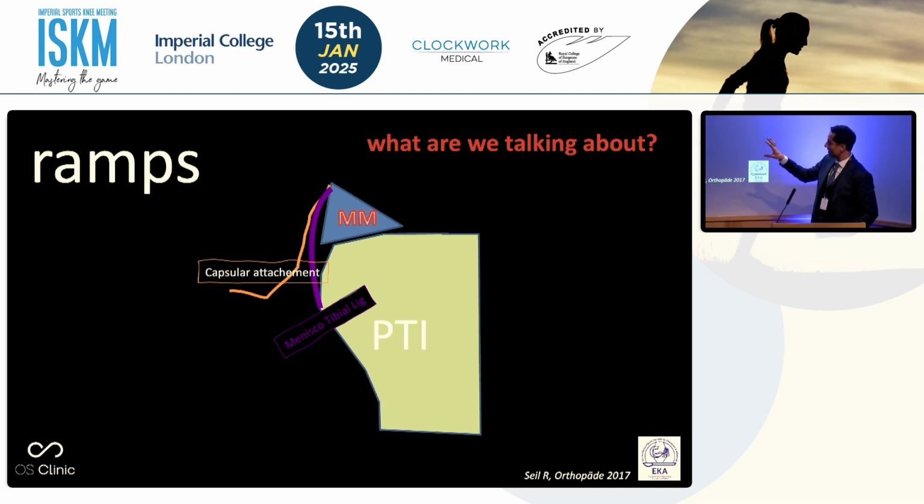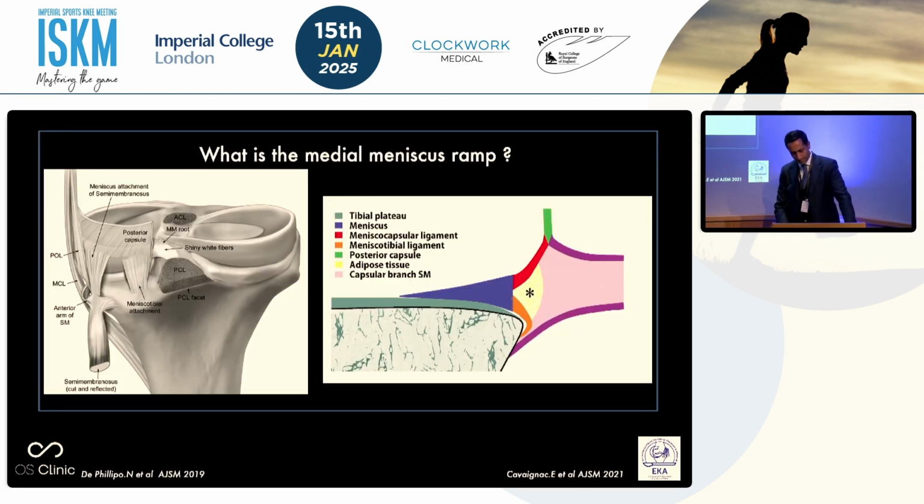And this nicely demonstrates the back of the tibia, you've got the medial meniscus, and then you've got the meniscotibial ligament along with the capsular attachment. And it is intimately associated with the semimembranosus bursa.